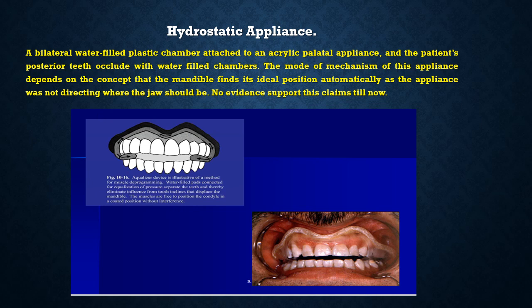The idea behind this appliance is that the mandible will find its way automatically by occluding against this water-filled chamber, and then relaxation will be encountered. But actually, there is no evidence to support this claim till now.